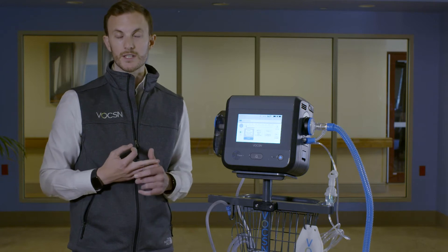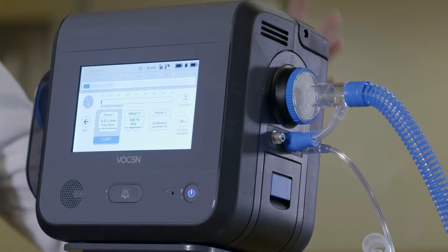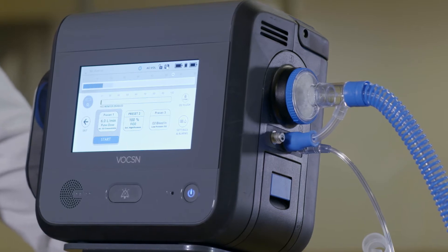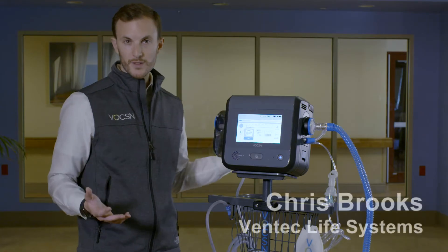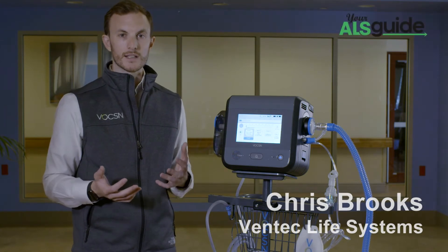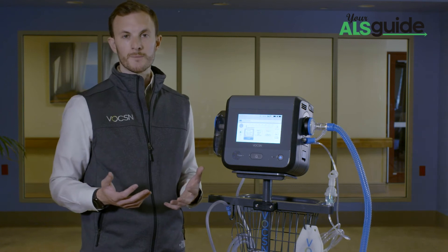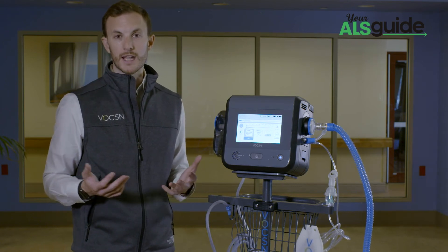Voxxin has three sources of oxygen: external high pressure, external low pressure oxygen, and also the internal oxygen concentrator. Most people with ALS often will not need oxygen, but in the event that you do, Voxxin has the capability of doing up to six liters equivalent, or 40% FiO2 in the average adult male.